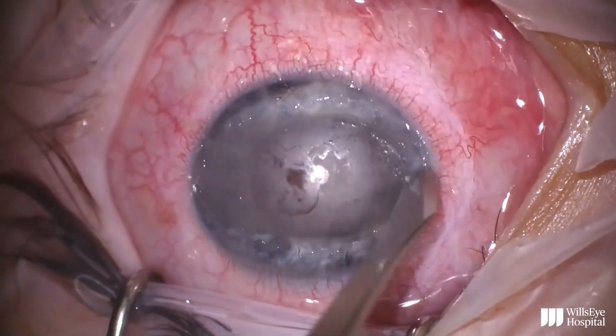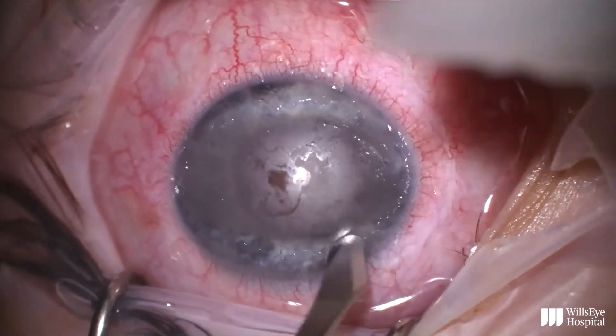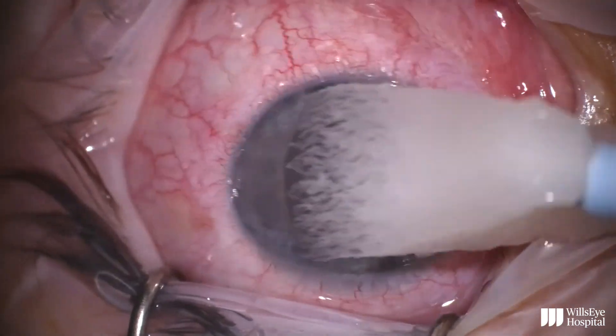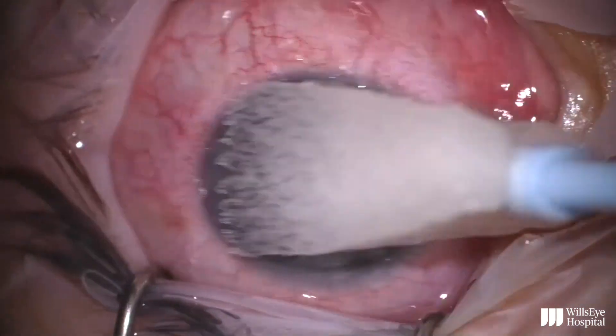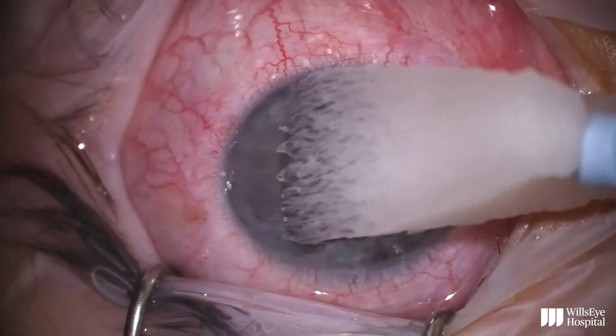Once the epithelium is removed, the next step is to apply EDTA to the corneal surface using a soaked Wexel sponge. I like to use small wiping motions to wipe away the calcium.